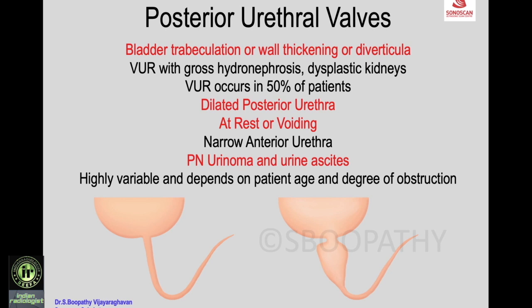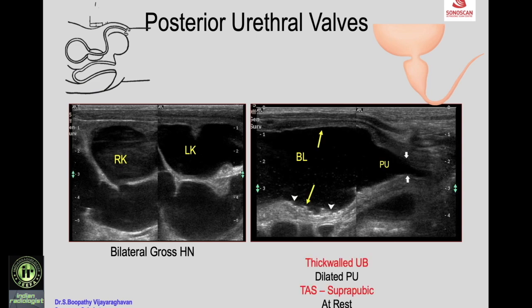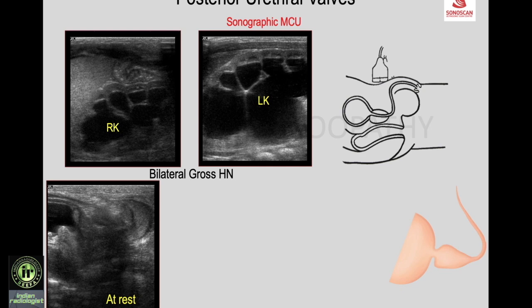A newborn with antenatal diagnosis shows bilateral gross hydronephrosis on scan. Sagittal scan of the bladder shows a thick-walled bladder with trabeculae, and transabdominal scan shows dilated posterior urethra at rest — the classical appearance of posterior urethral valves. Another case with bilateral gross hydronephrosis shows a thick-walled urinary bladder but without posterior urethral dilatation at rest.